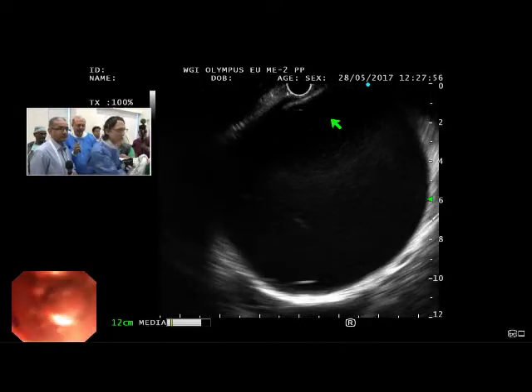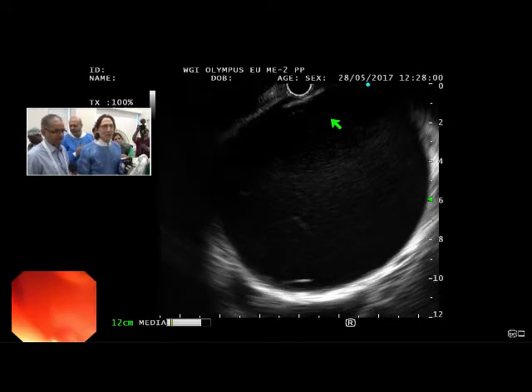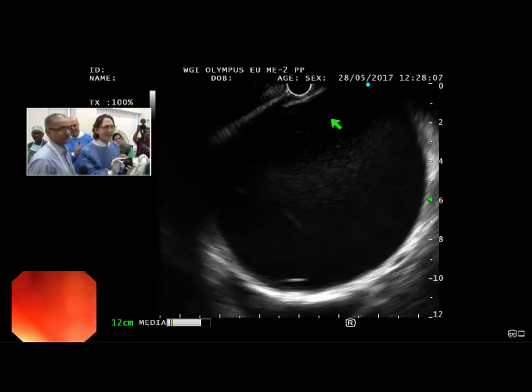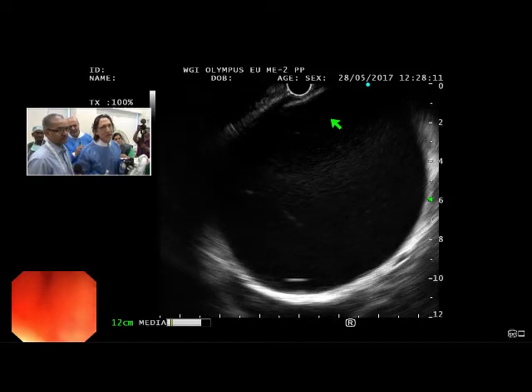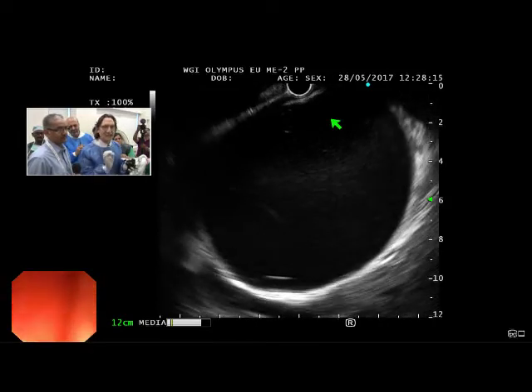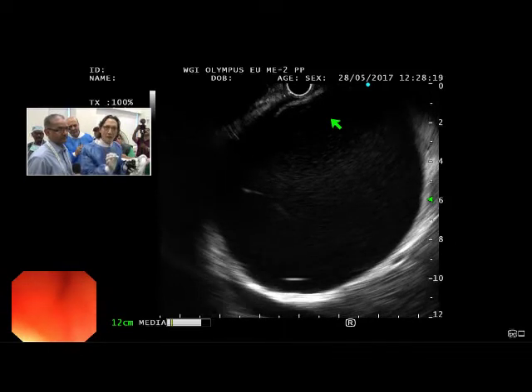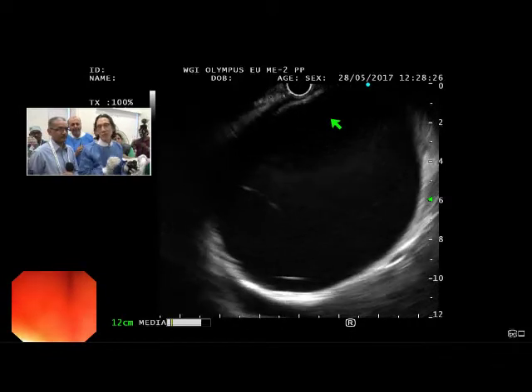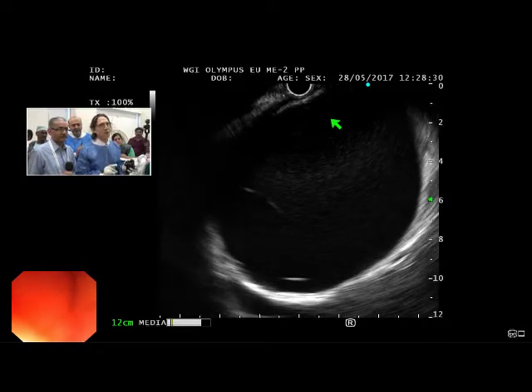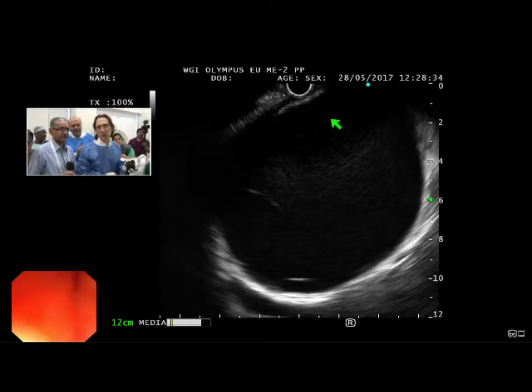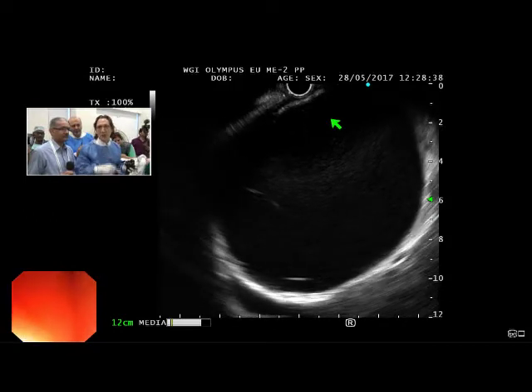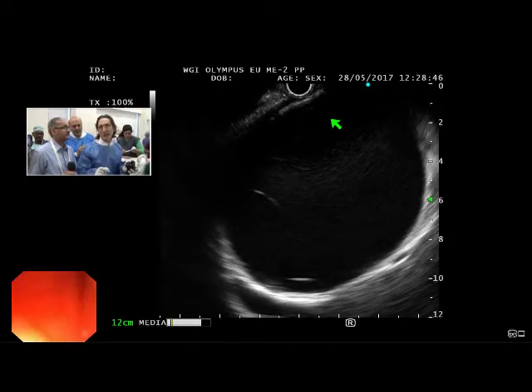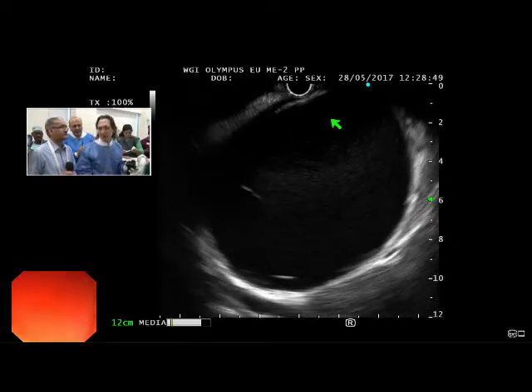Would it be inappropriate to use a plastic stent in this patient? It may be inappropriate because you see that echogenic fat layer between the two walls, meaning there is not ideal adherence. You may be okay, but if you dilate too aggressively when placing your plastic stent — that is, if the stent does not snugly seal off the fistula tract you created — then you could get leak between the cyst wall and the stomach wall. You must be very careful not to push the cyst wall away. These are the common mistakes made when performing pseudocyst drainage: using the Seldinger technique and exchanging over the wire for different instruments may push the cyst away, including when you place the stent.